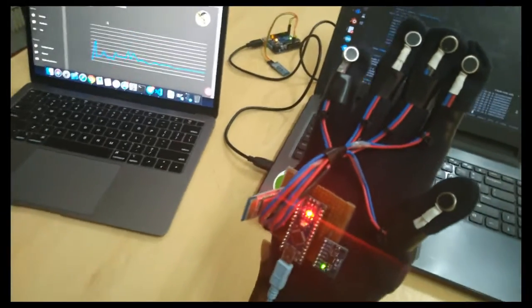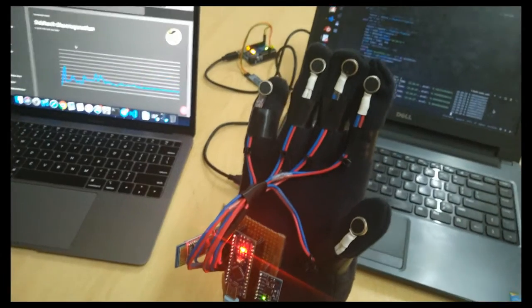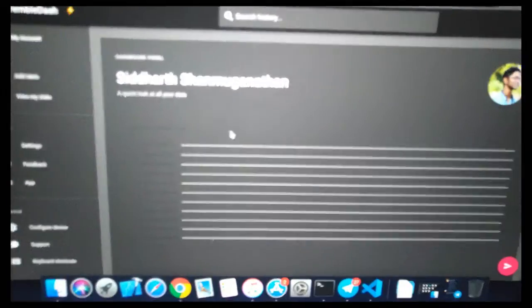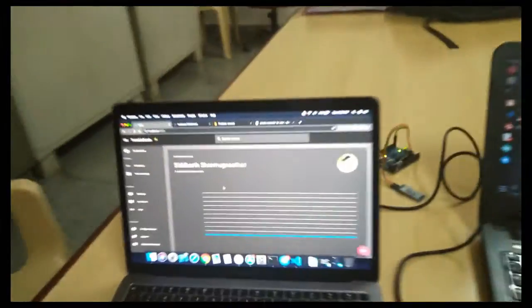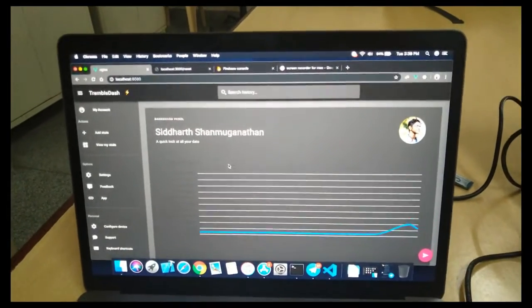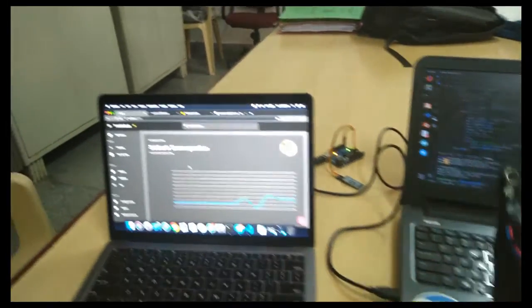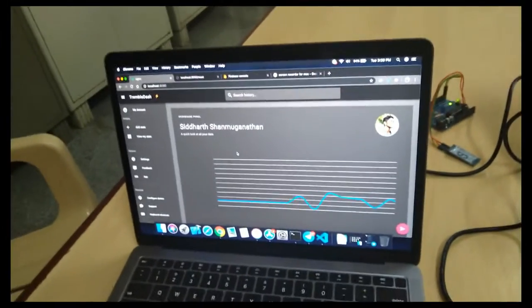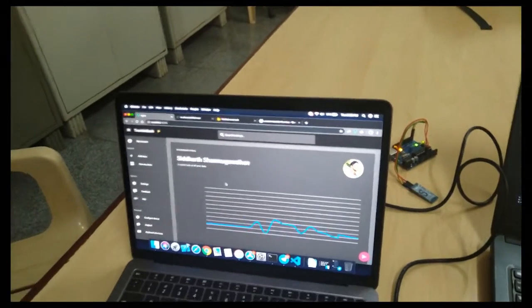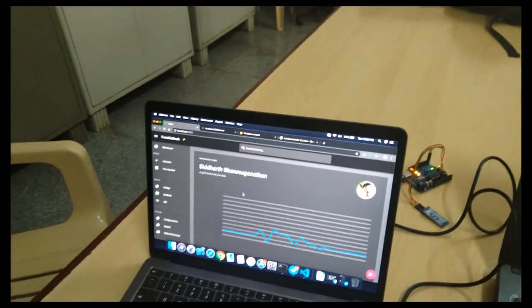Your hand gives a fundamental tremor, that tremor is observed, and we generate a counter vibration for it so as to keep you very comfortable. And this data is what you are seeing right now on the screen. The hand tremor is not there absolutely now. Now we are showing you the data for mild tremor. You can see that. Likewise, we are capturing the real-time data, and all these are very clearly done in real time. We hope you will understand this better and appreciate it better when you have it in your hand and feel the system. Thank you.